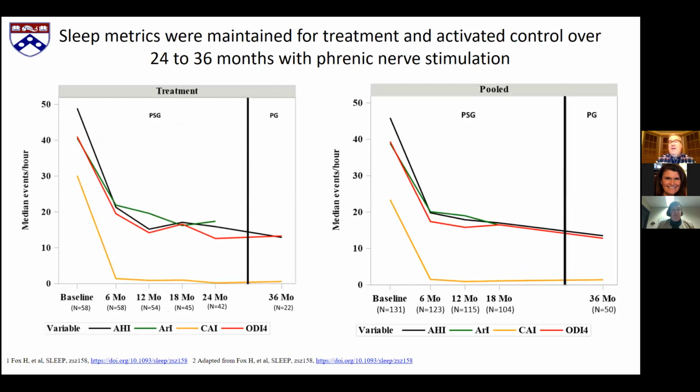Now, we do have data out even longer than 36 months now, which I'm sure Robin can comment on. But what we showed here is that patients had ongoing benefit from the device out to 36 months and beyond. And that's very reassuring that the efficacy of the device is persistent, because we hope, at least as heart failure docs, that that's going to help us then remodel those ventricles and hopefully move on to improved outcomes, which is really our hypothesis.